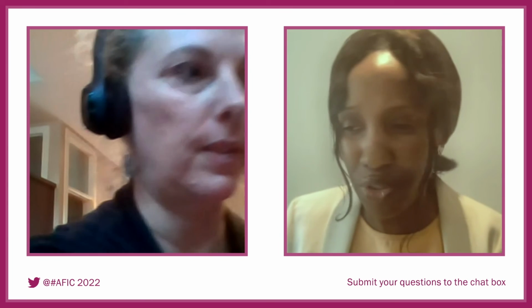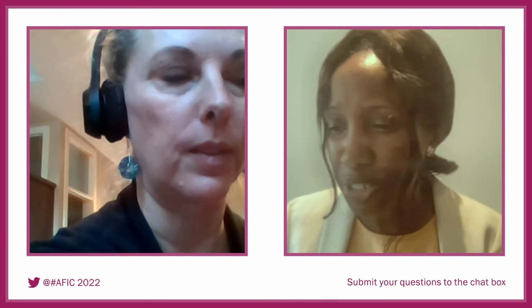Yeah, there's always people who will try and objectify things to put numbers on it. I'm sure there are papers that would suggest that, if they are actually validated, but most often it is subjective. I know that our practice has been not to use specific measurements, but to use the subjective appearance of the lambda versus the T. And I would agree with that because there are a number of factors that contribute to the chorionicity. So it's better to use all the information, not just one single measurement.